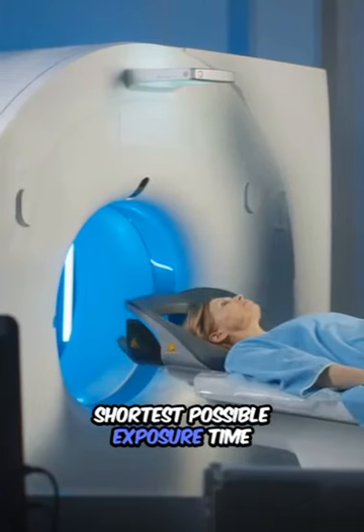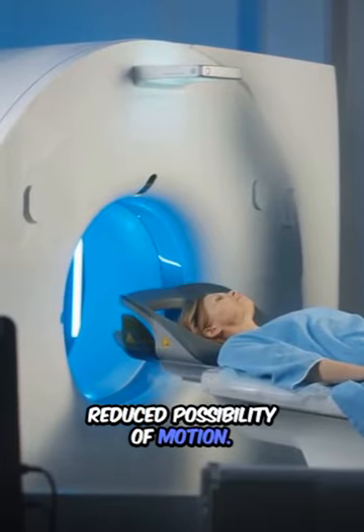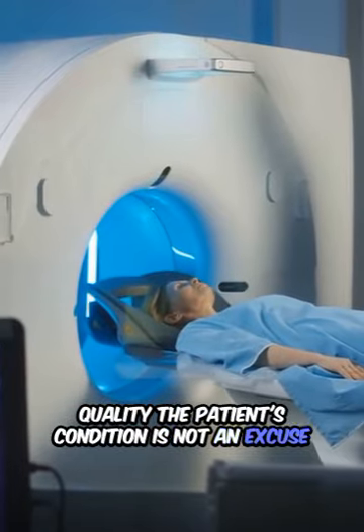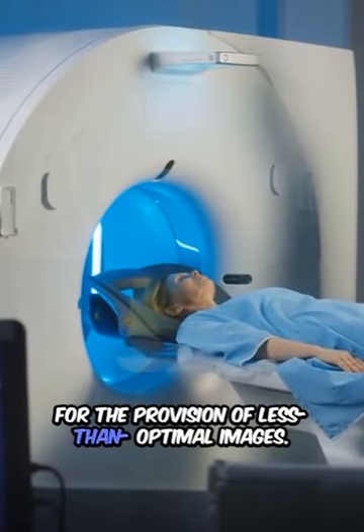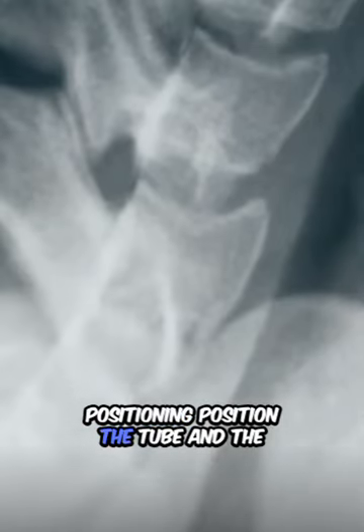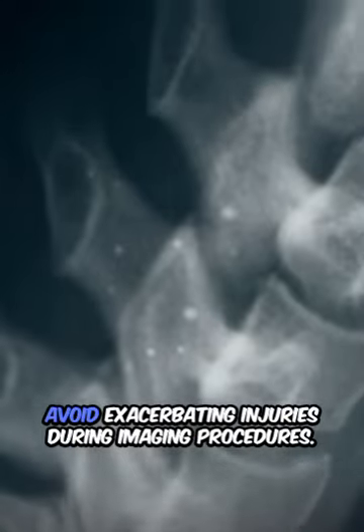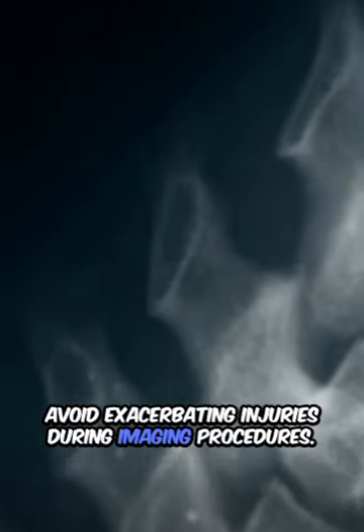Shortest possible exposure time reduces the possibility of motion. Quality: the patient's condition is not an excuse for the provision of less than optimal images. Positioning: position the tube and the IR, rather than the patient, to avoid exacerbating injuries during imaging procedures.